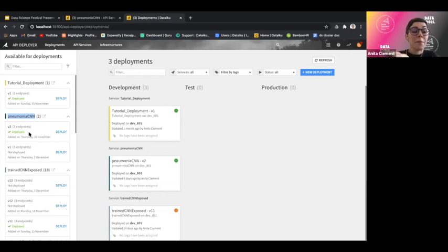And you can see that this version 2 has already been deployed. So I deployed the first version, then made some modifications, so I deployed a second version and updated. And that's also where you finally deploy to the API node, because when you push to the API deployer, you just load it to that management UI, but then you still need to push to the API node to finally allow people, wherever they are, to send a request to your endpoint and get back a pneumonia prediction or normal prediction.